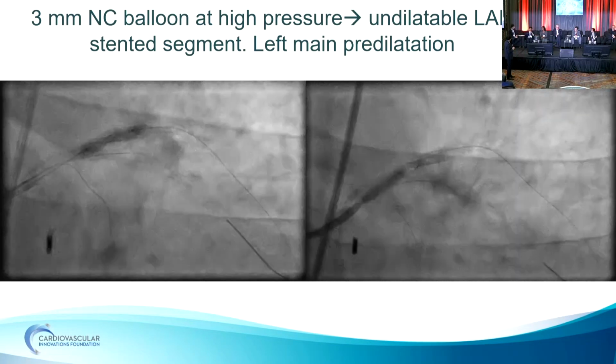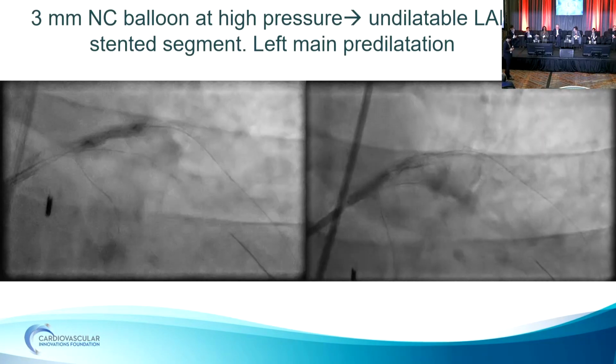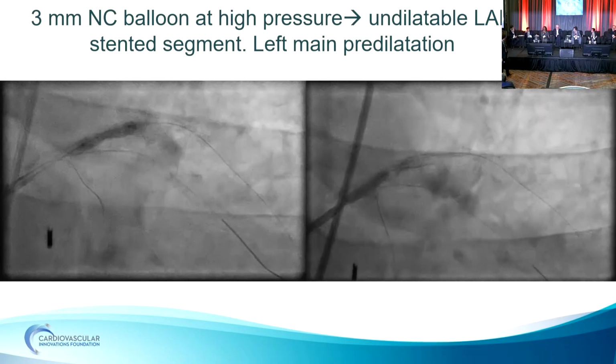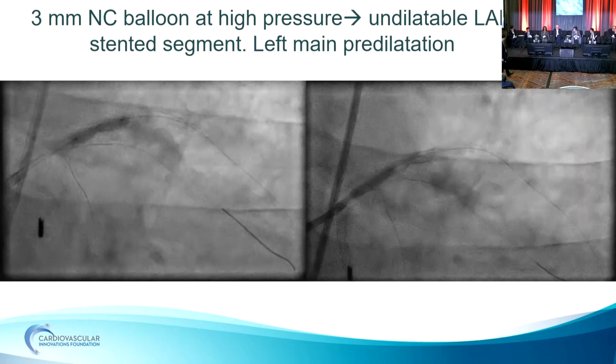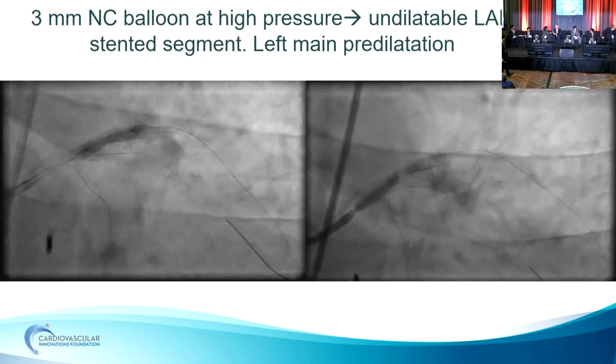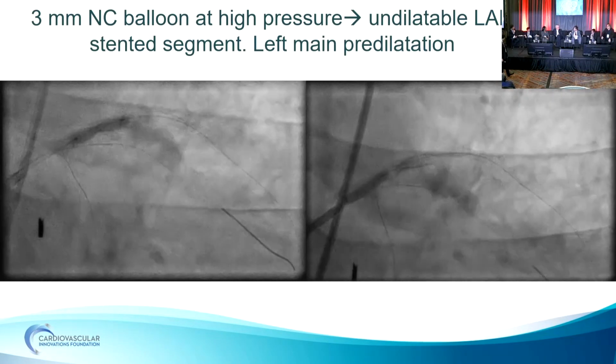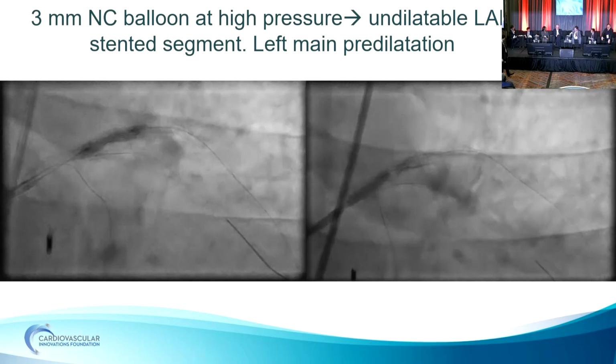You have to be patient with laser though. I usually start off, first of all, using a non-compliant balloon and see if that works first. And if that doesn't, then I escalate to other therapy. Shockwave, and if it doesn't work, then laser with contrast.